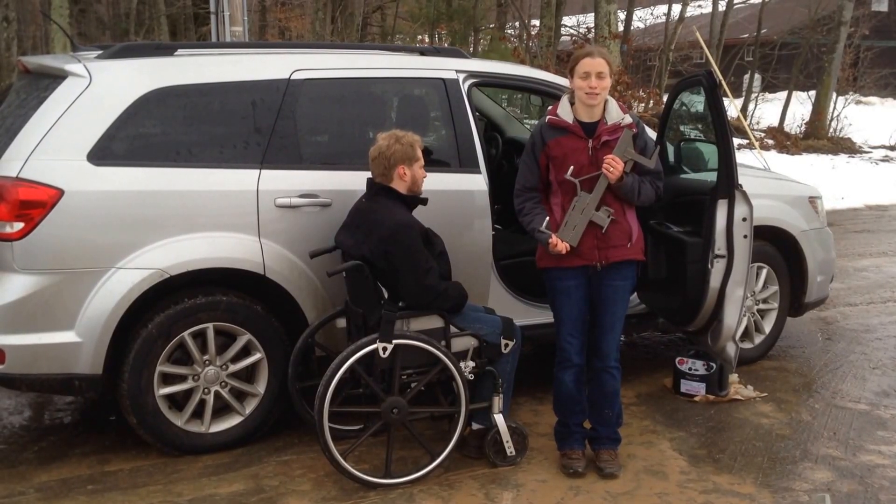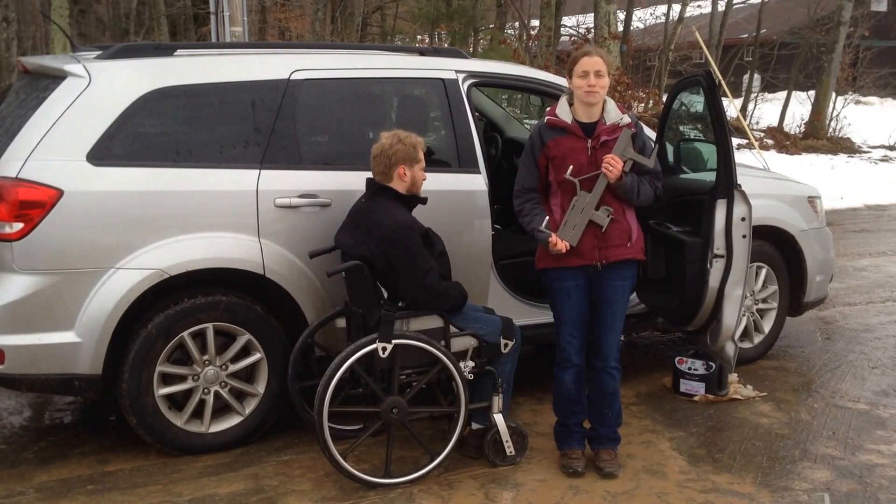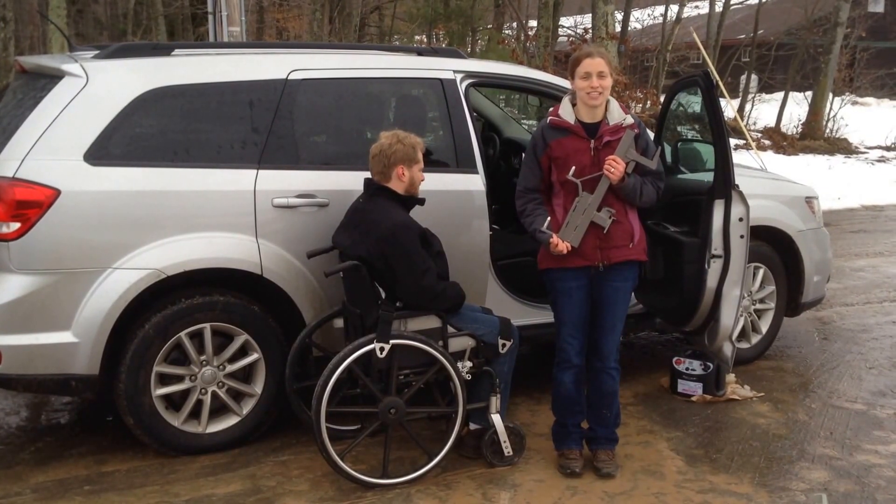Thank you for joining us. Today at Access Unlimited, we're looking at the use of a speedy bar and multi-lift in a 2013 Dodge Journey.